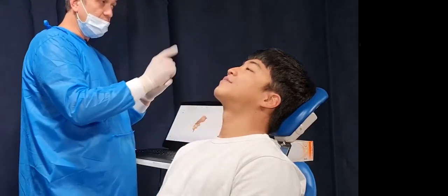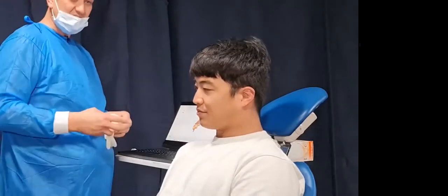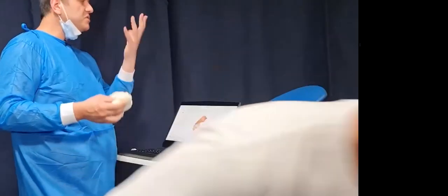Well, that's your one tooth. Now take those principles with you. Thank you, Mr. Patient, you can jump out now. Take those principles with you as you see your patients, and again, it's just that finger support, and all those pre-fundamentals that Joe and I spoke about last week will really, really assist you in getting those undercuts.